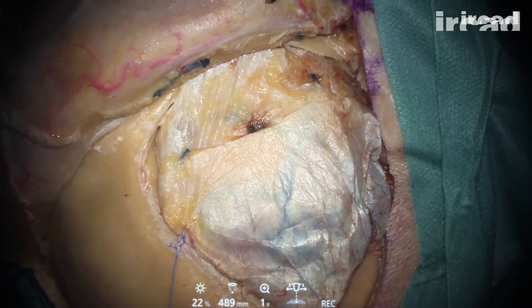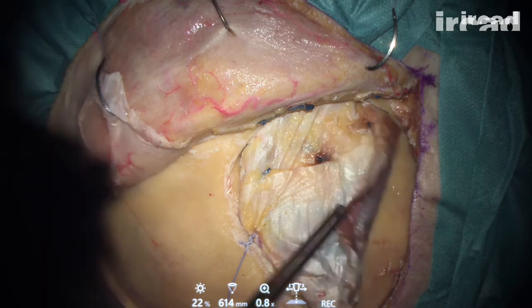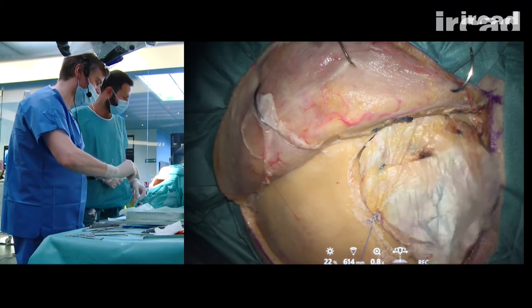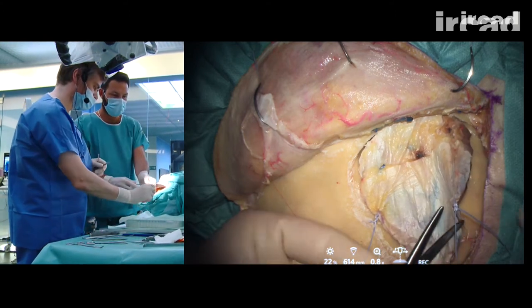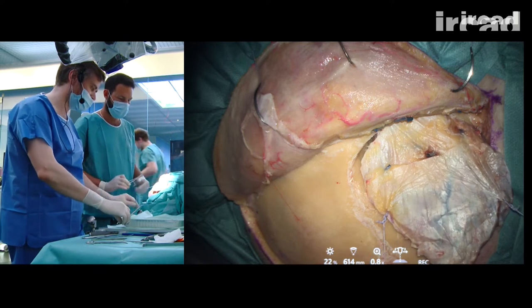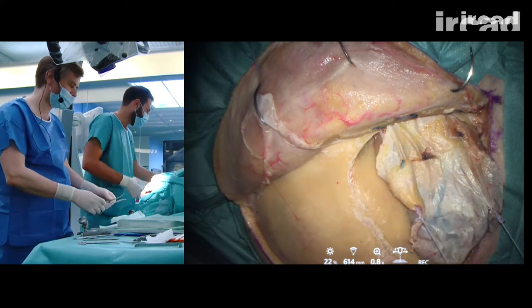I put two stitches in order to be able to mobilize the muscle anteriorly, posteriorly, depending on the surface of bone I want to expose. Okay, here I expose anteriorly, here I expose posteriorly, periosteum is intact.